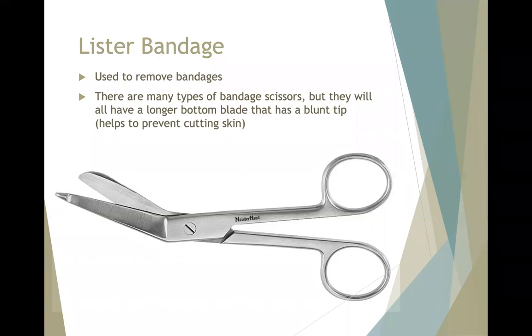And you might see them looking a little bit different. I do own a pair that's really, really slim. So it's not as bulky in the end. It's actually a lot more narrow. And it's just different styles of it. And it's kind of just for your comfort. But these are generally what our bandage scissors look like.